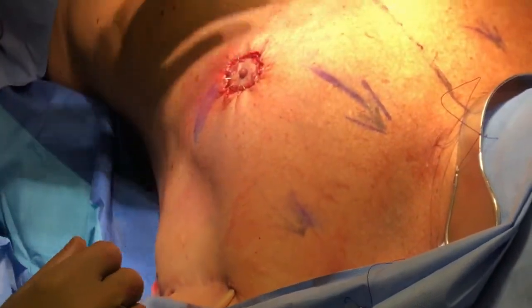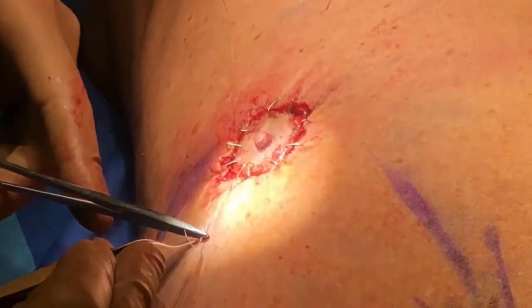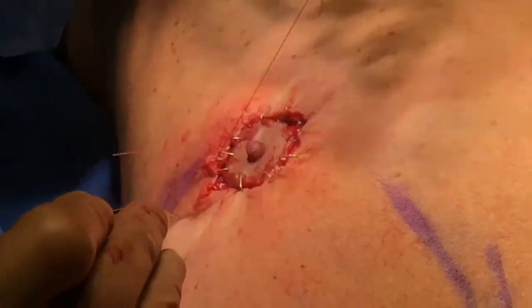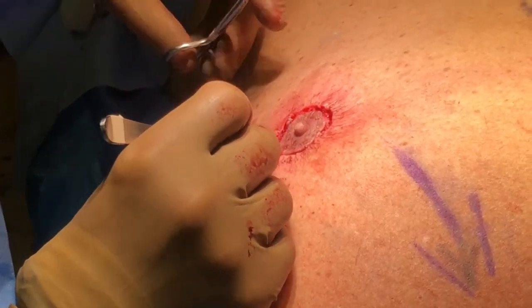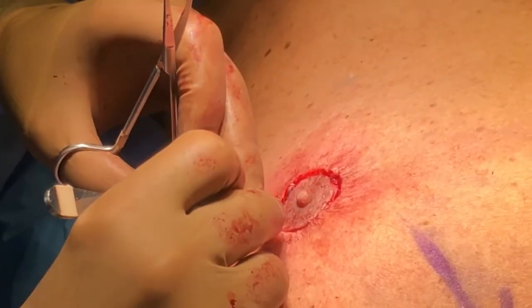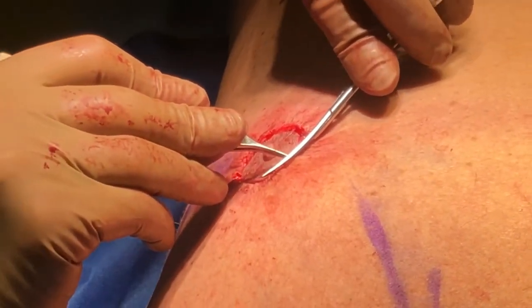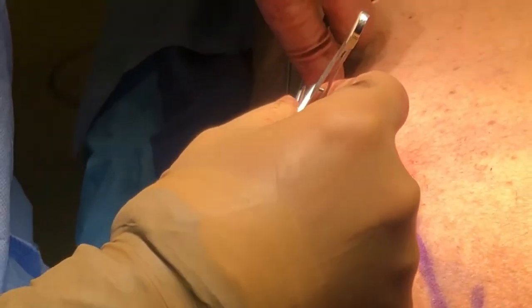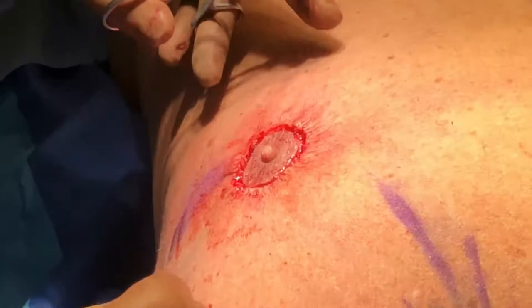So now we're going to bring this together. We're going to start with the 3.0 Vicryl — I already started at five o'clock on this side and seven o'clock on that side. So we did a 3.0 to bring it in, our purse string. Then I put interrupted 4-0s buried. Now this is my last chance — I want to trim it up. If you have two circles, a circle within a circle and they kind of match up, you're going to pretty easily match up with your final closure. If there's complete discrepancy, you're going to have tension that's going to cause it to be wide, long, teardropped, or something like that.